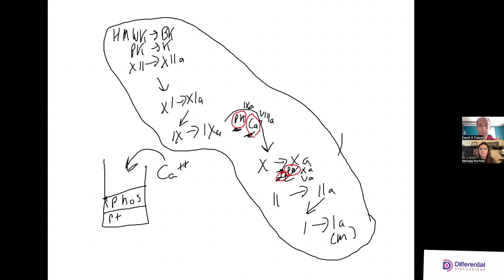And then there's also an optical method, right? For the optical method, the entire time the reaction's taking place, we have a light source and a light path monitoring system of some kind, right?